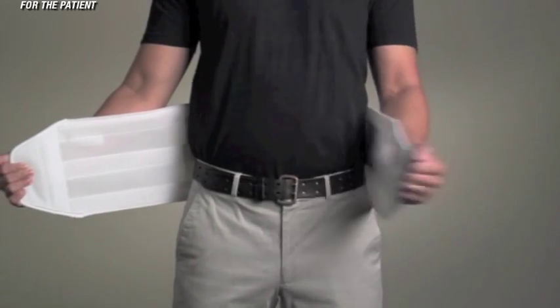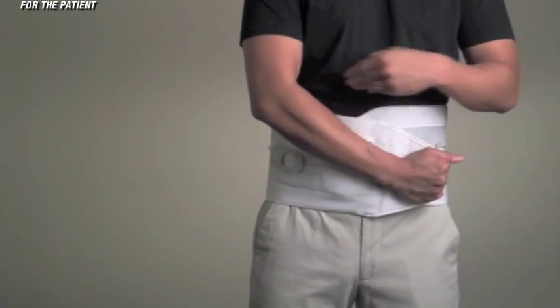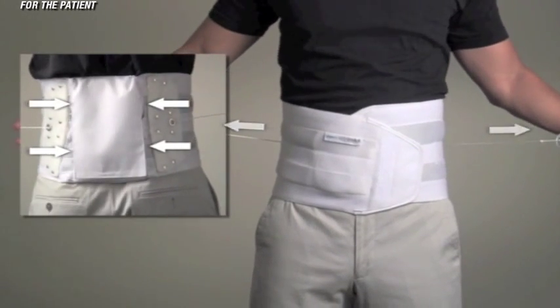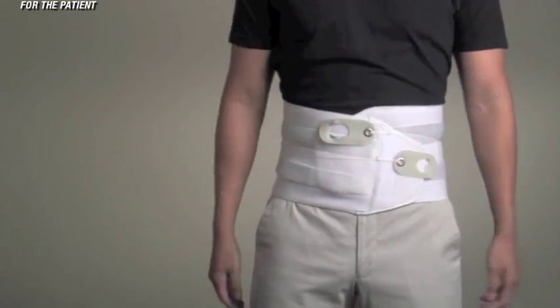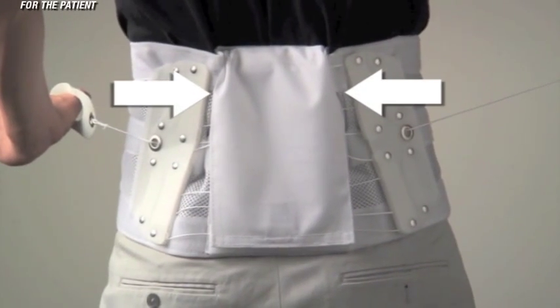The Quickdraw Pain Relief Orthosis, or Quickdraw Pro, was developed by Aspen to provide compression for the relief of low back pain. Two patented SlikTrak tightening systems are easy to tighten, as they are designed to provide a 4-to-1 mechanical advantage in both upper and lower regions. The ability to tighten each system independently allows the patient to localize their therapy.